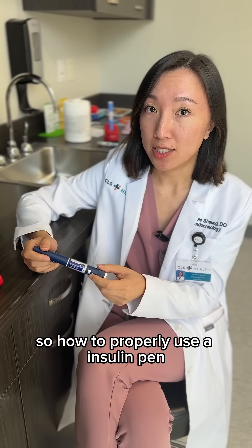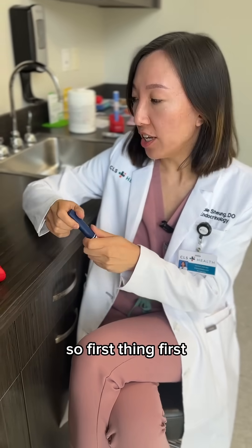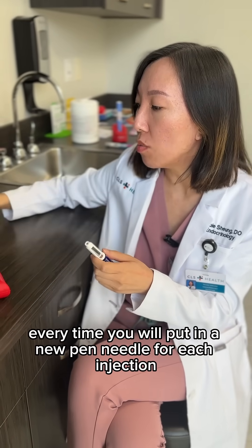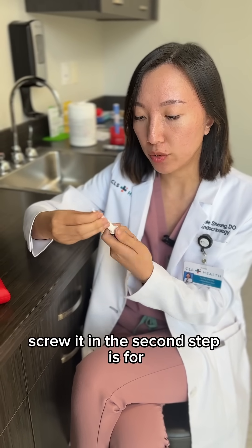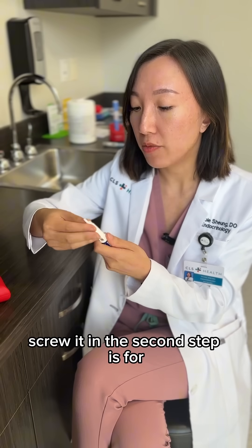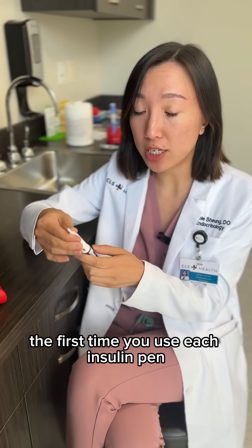How to properly use the insulin pen. First thing first: every time you will put in a new pen needle for each injection and screw it in.